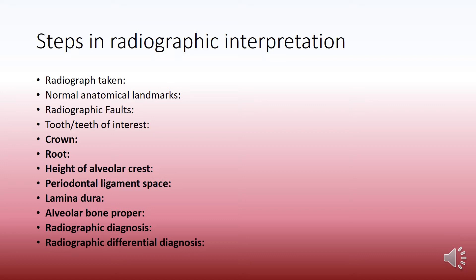Periodontal ligament space, lamina dura, alveolar bone proper, radiographic diagnosis and differential diagnosis wherever appropriate.